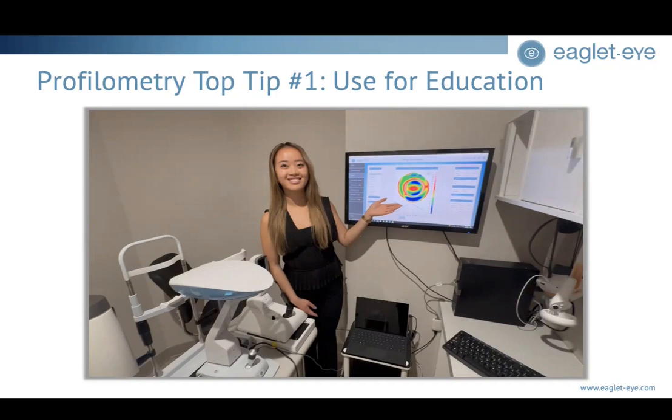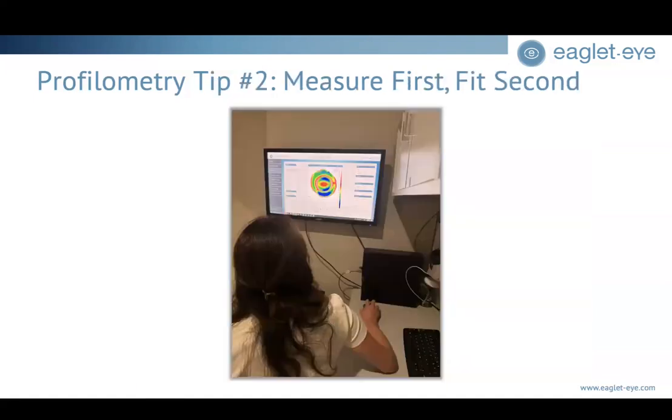So the profilometry top tip number 1 in the clinic is we love using it at our office for patient education. We use it in marketing. We use it to stand out from our competitors. There's something a little different that we can offer above and beyond just the simple reality of precise measurement before fitting lenses. So tip number 1, use for education.